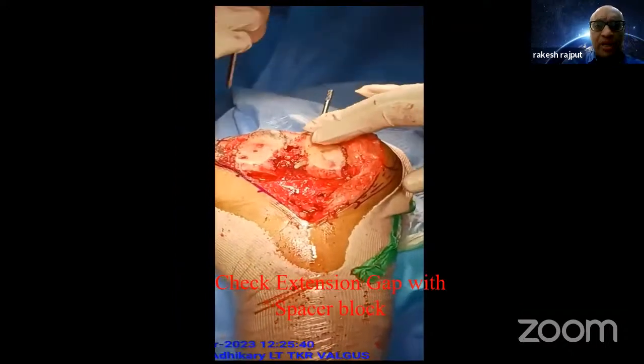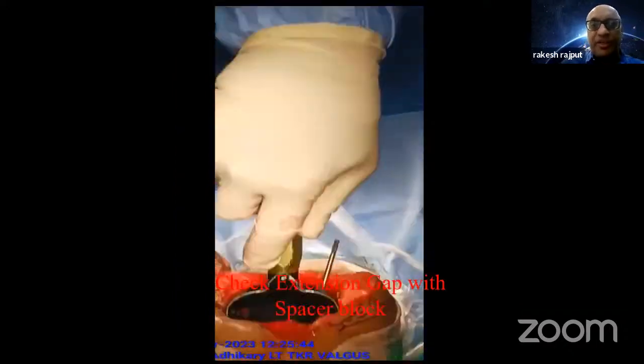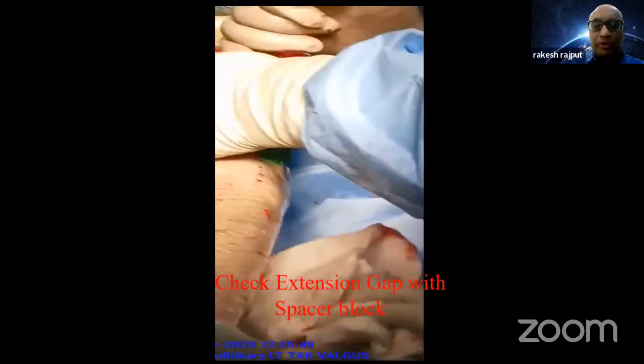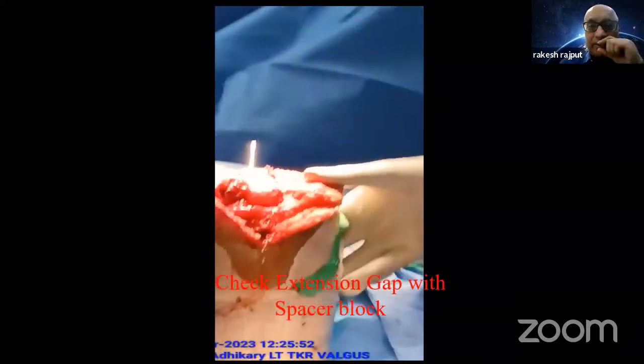So you do the cut. I'll skip some steps. So you again check the extension gap, and it is invariably going to be exactly what you've actually planned it to be. And now this is the place where you find if there's some tightness or where you can release it.